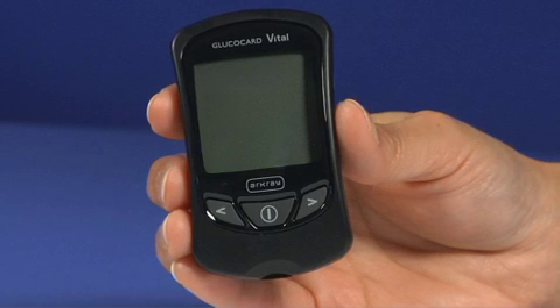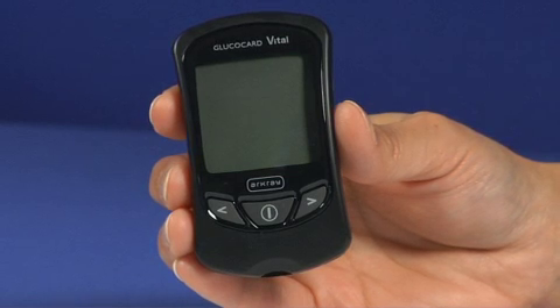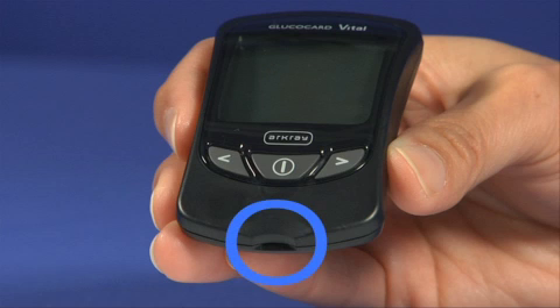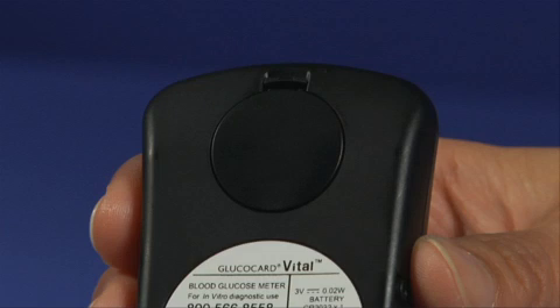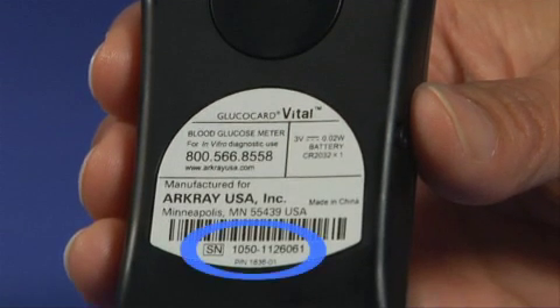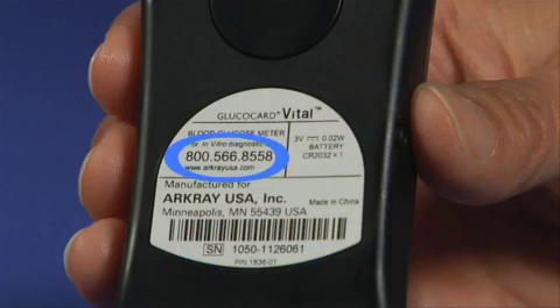Now let's take a moment to become familiar with the Glucocard Vital System. Key points of the meter include the display screen, on-off button, back button, forward button, and test strip port. On the back of the meter you will find the battery compartment, serial number, and customer service number.